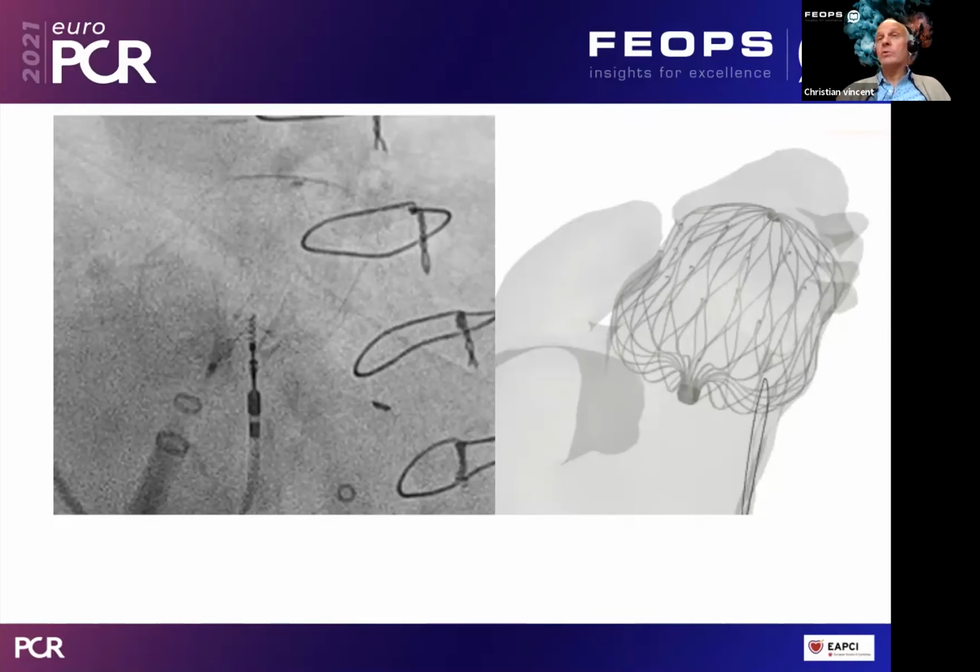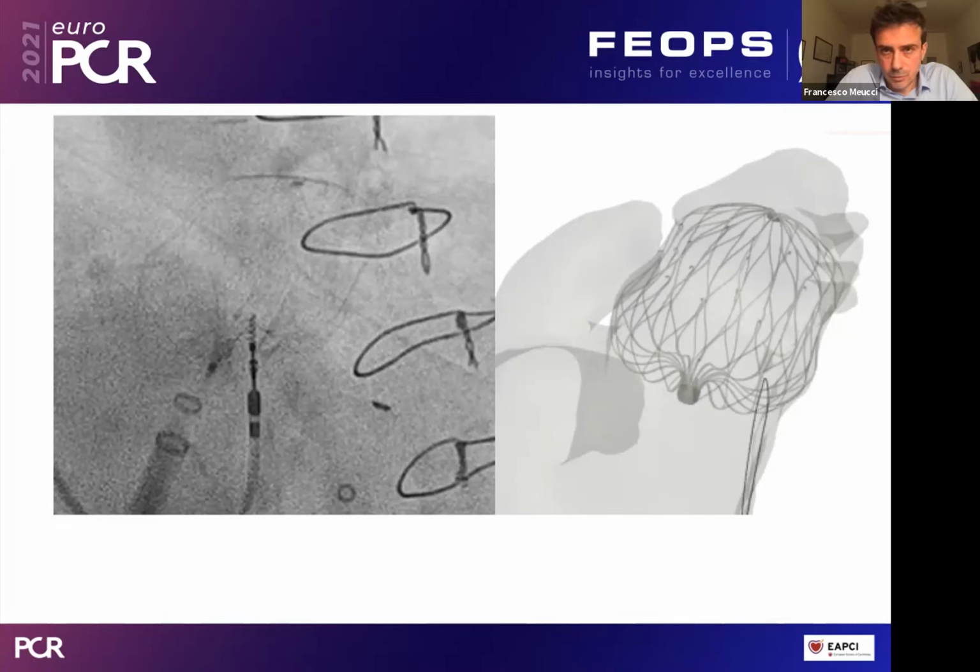We also follow those types of recommendations, but we are now also considering, in future development, trying to make some evaluation with the echo images as well. So that's in a nutshell the actual situation. Any other comments on that, Francesco, based on your experience? Is CT a good decision for FEops HEARTguide to focus on for the moment? Yes, for sure. I am 100% enthusiastic about CT scan planning for LAA procedures.